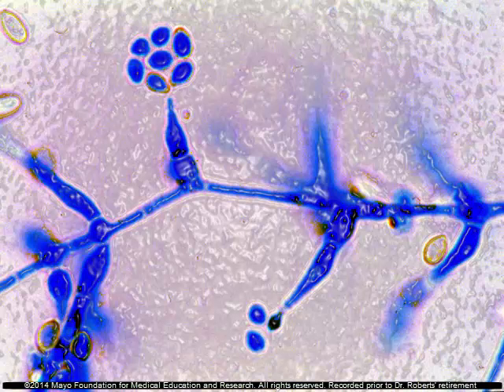This is one where you see it very well. You notice at the top there is a cluster of conidia, and notice the brown ring, you can see the brown pigment on those. Follow it down and look at the conidiophore. It is swollen before it is attached to the hyphal strand. So some of these spores in here happen to be brown in this particular mount. In others, you will see that some of these conidia are not pigmented at all. They're hyaline. So this is Scedosporium prolificans.